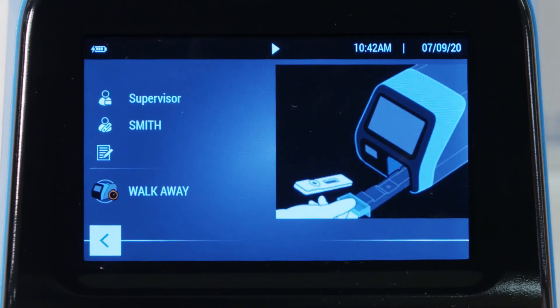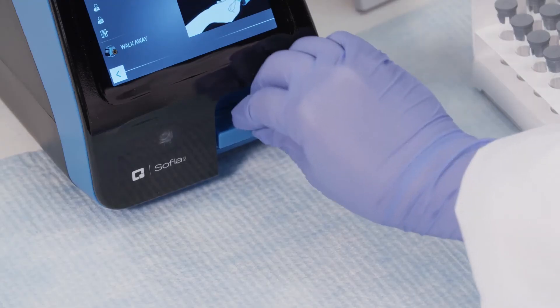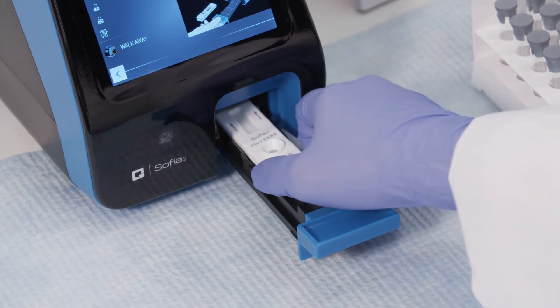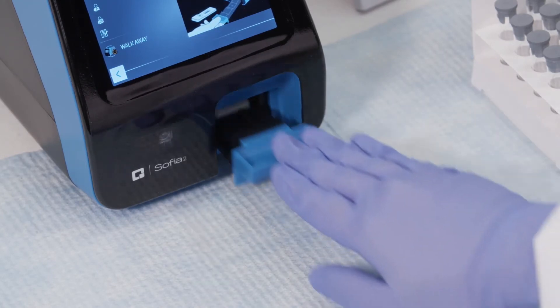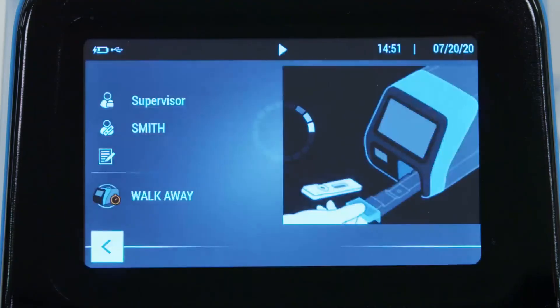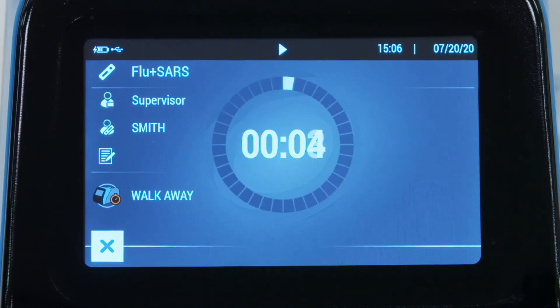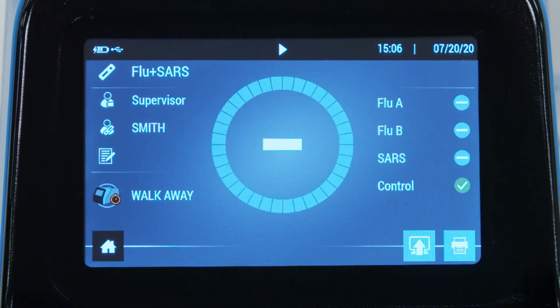The user will then see an on-screen animation instructing them to open the cassette drawer and insert the patient sample. Once the drawer is closed, timing will begin automatically. When in walk-away mode, SOFIA2 will scan the patient cassette during the 15-minute incubation period. When the test is complete, the results screen appears and informs the user if the test was positive, negative, or invalid.